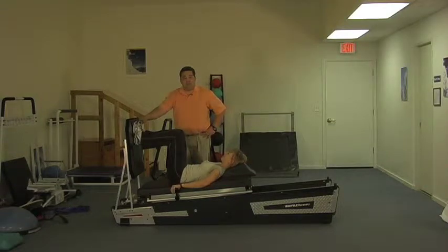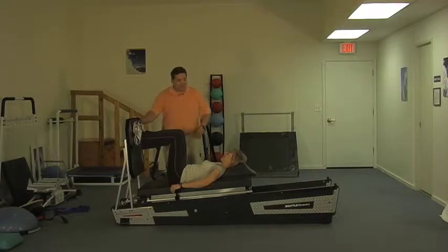We changed models once again. We've got no shortage of healthy athletic PTs. This is Siri Berg, PT. Thanks again for the help. She's going to help us demonstrate both the way we can use this to do some plyometrics as well as some eccentric loading for the lower body.